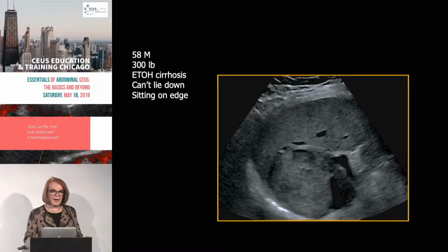Now, what about another patient? This was a patient that my technologist came and said to me, maybe we shouldn't do this patient. And of course, I've already said to you, I never turn down anybody. It doesn't matter, even if they weigh 300 pounds, drink too much, and are not totally cooperative. So the patient comes, and I said to my tech, just do the best you can, bring it to me so that I can at least see, maybe we'll do contrast, maybe we won't.